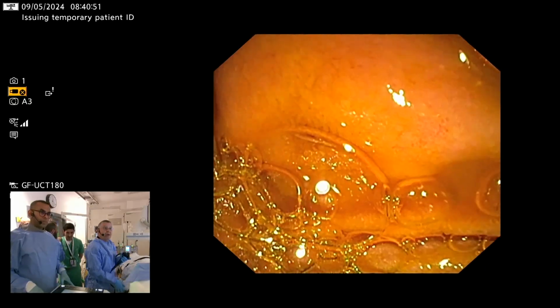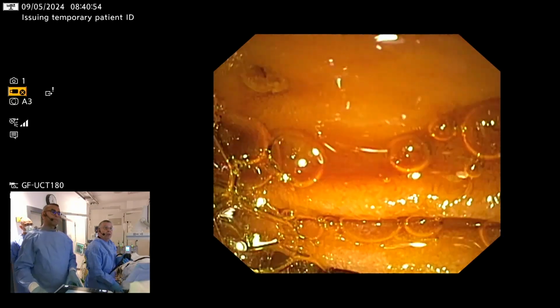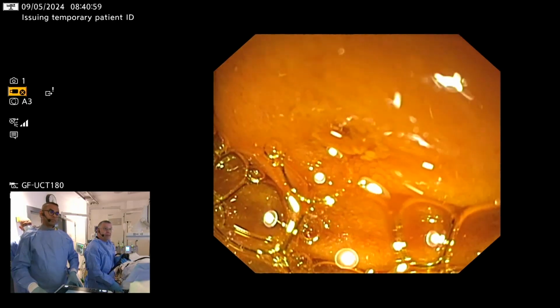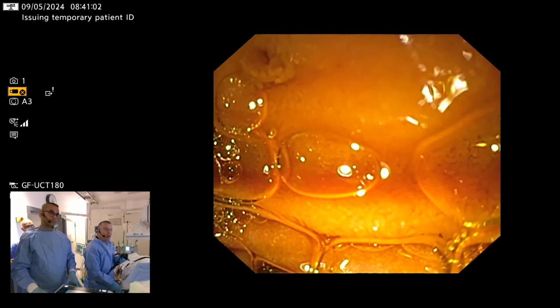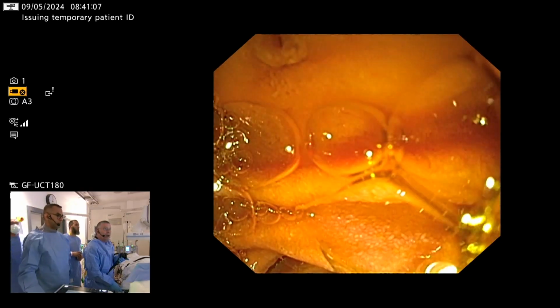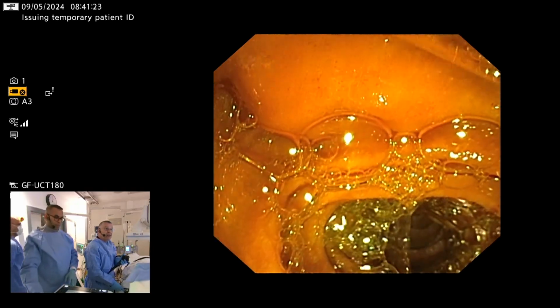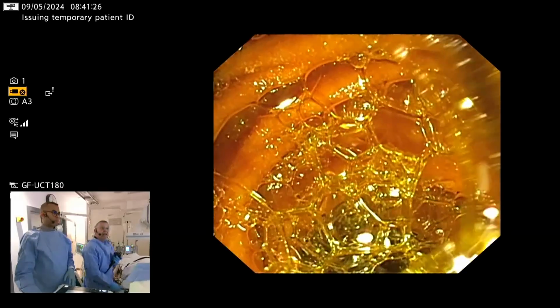You see here we have a normal papilla. So we have a normal papilla, no adenoma. We have seen the ampulla itself with the bile duct inside the ampulla, which excludes an ampullary tumor. Intraampullary tumor never exists if you see the dilated CBD inside the duodenal wall, and we have to verify that the papilla is normal, and it is the case here. So now we can exclude definitely the organic obstruction.